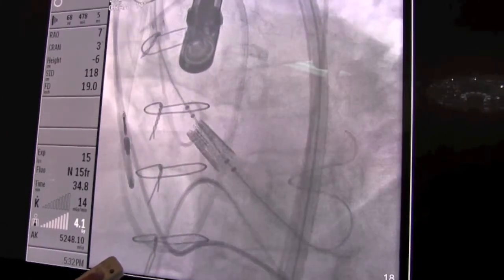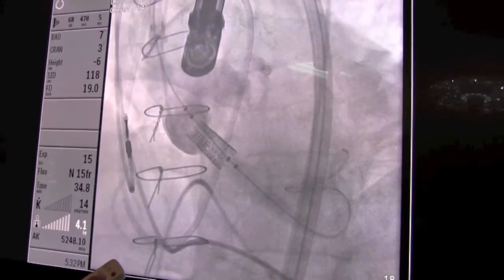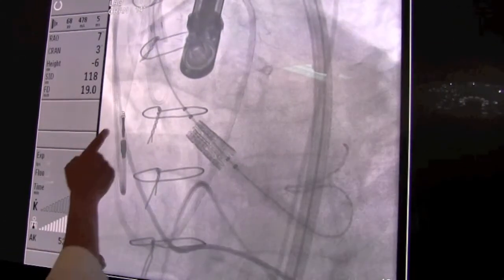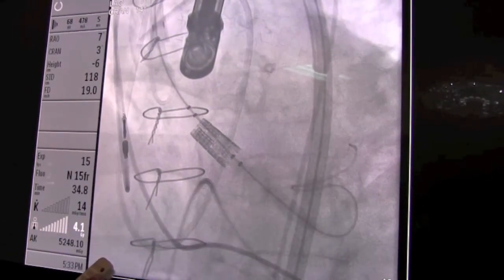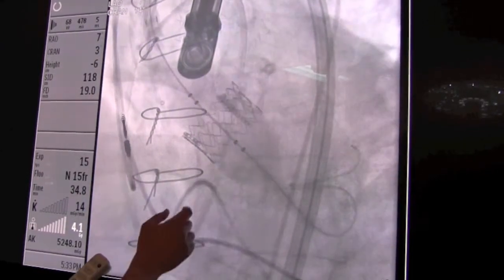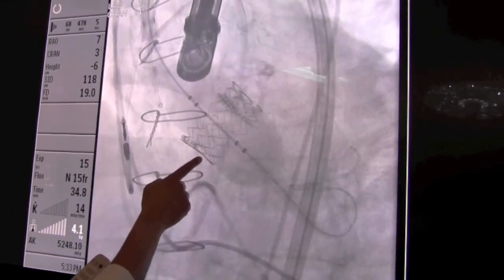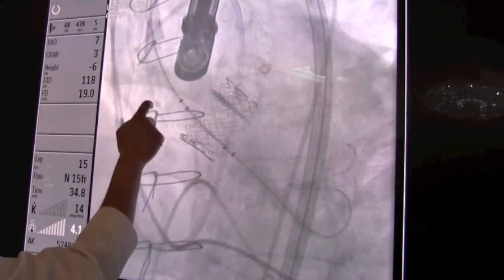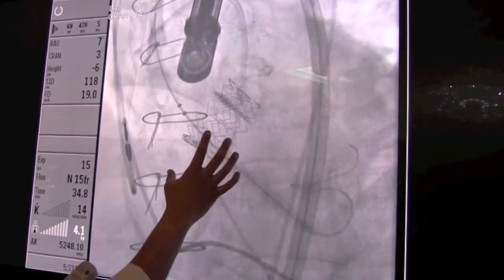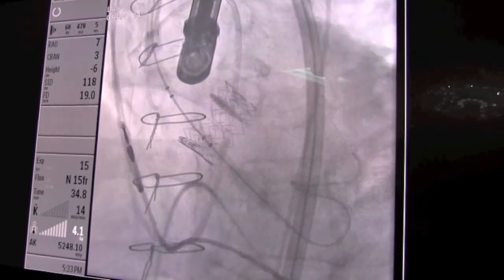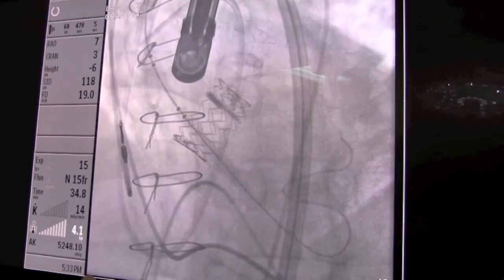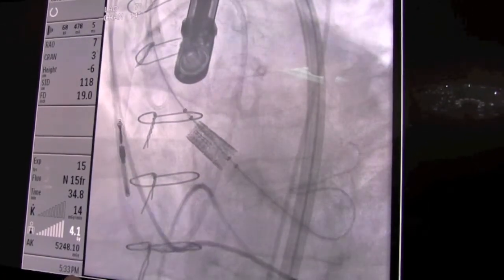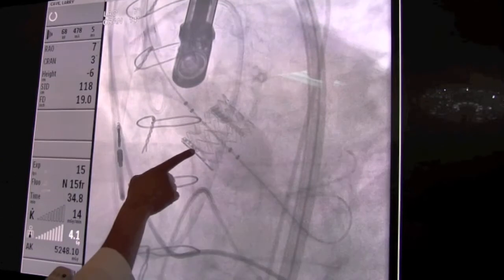We're still positioning the valve, and then finally when we're happy with the position we pull the pigtail catheter back and we rapidly pace the heart so that it doesn't shoot out the valve. We inflate the balloon that the valve is mounted on — you can see the outline of the balloon — and that deploys the valve, letting it take its full shape, locking it into place in the patient's aorta and pushing that old valve off to the side.